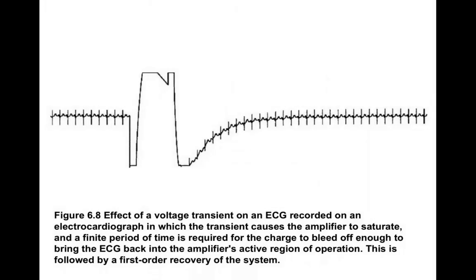As with all measurements, when we make an ECG measurement, there are obviously things that can go wrong. And it's particularly significant if you're in an ER environment or another diagnostic environment where critical healthcare decisions are being made, that the measurements that come in are accurate and trustworthy. So in the next few slides and in this short video, we'll talk about what are some of the things that can go wrong with an ECG measurement and how we can possibly mitigate those.